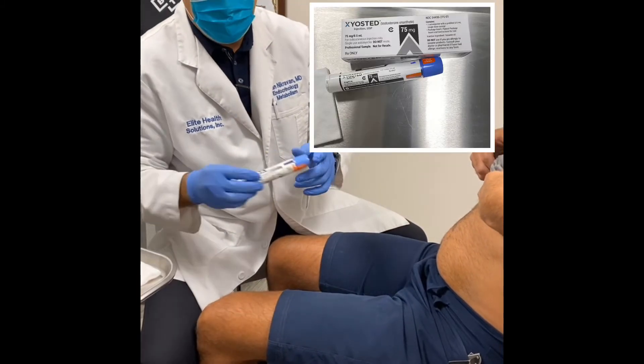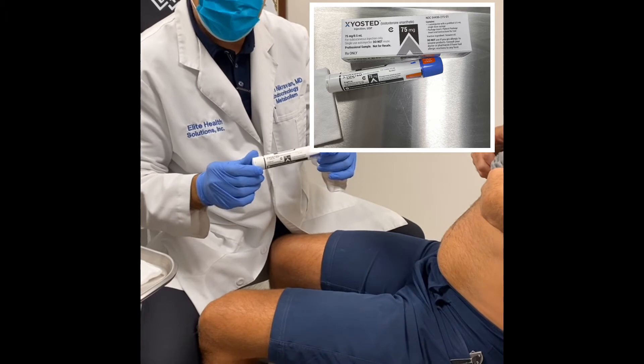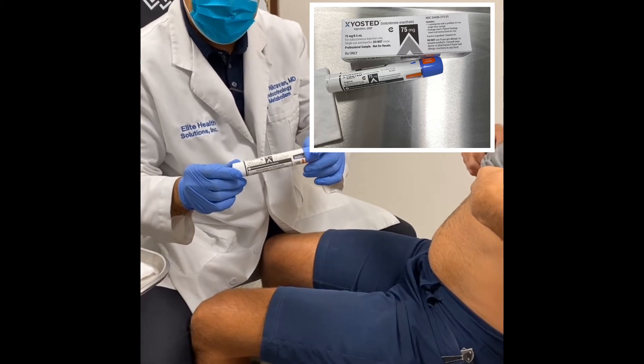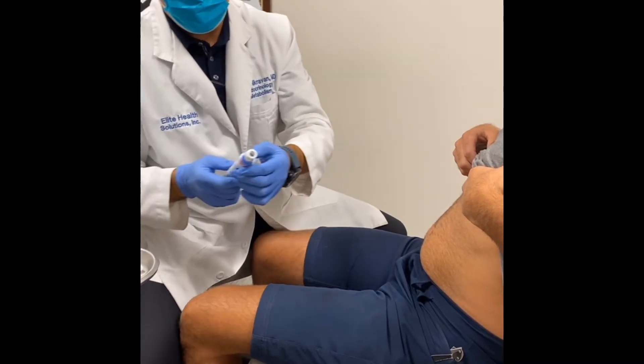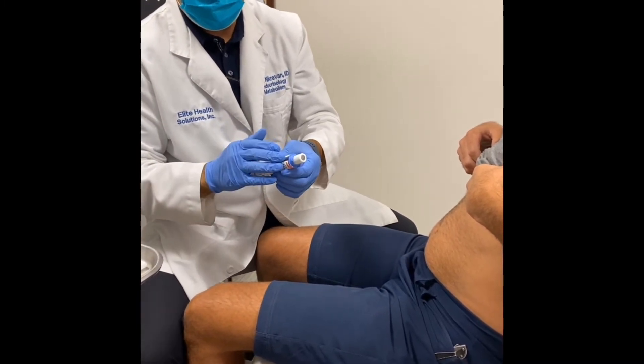We're going to be giving a testosterone called testosterone Xyoste 75, which is testosterone — I'll show you here. It's an auto-injector which has a spring-loaded pen and the testosterone is inside.